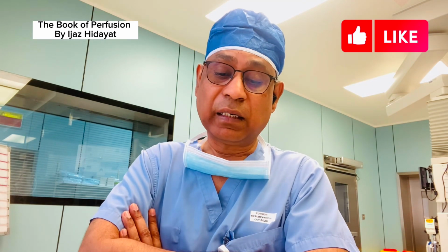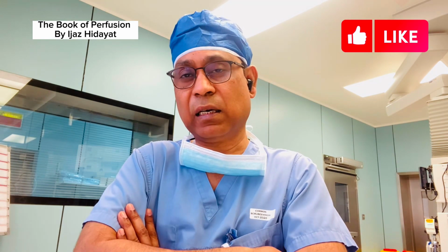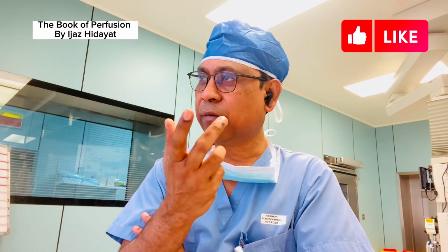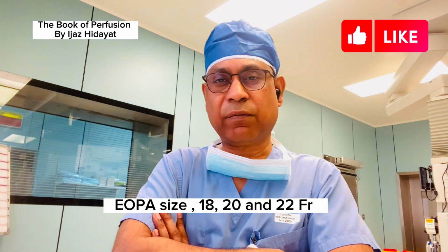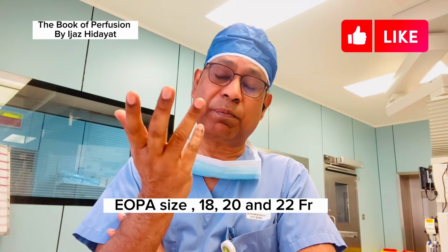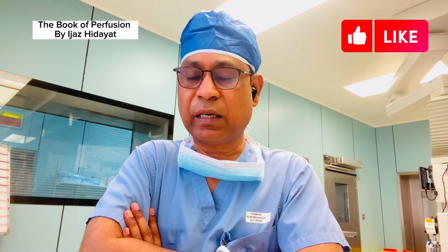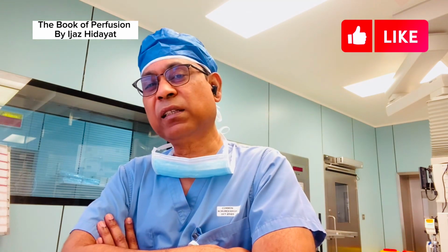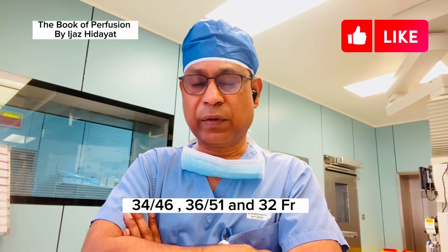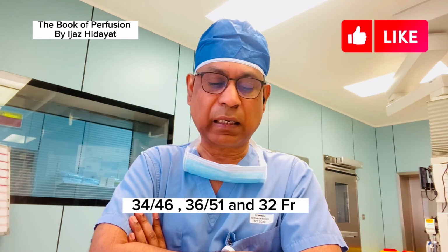Once they decide to go on cardiopulmonary bypass, of course we require the cannulations. For cannulation, in our center we normally use an EOPA cannula from Medtronic. EOPA comes in 18, 20 or 22 French. It depends on the patient's height and weight, and we decide according to that and select the arterial cannula. For the venous cannula, usually we use a double lumen two-stage cannula like a 34 by 46, or 36 by 51, or sometimes we use only a single stage 32 cannula.